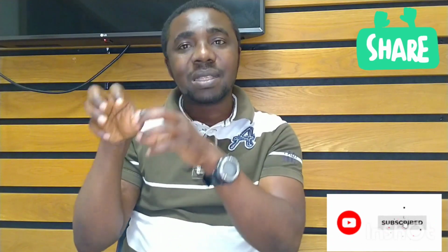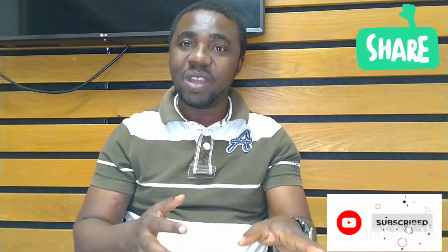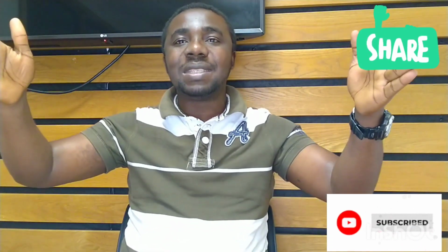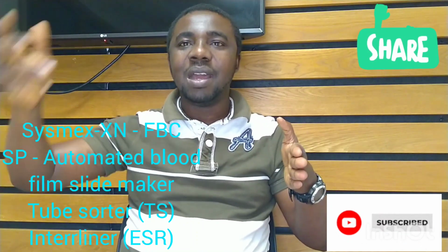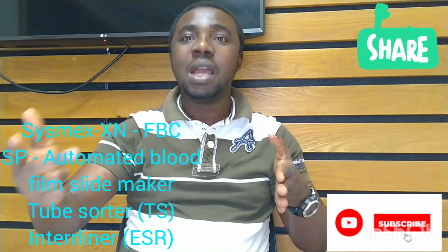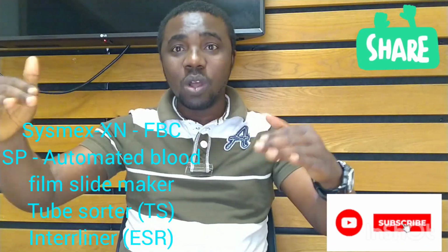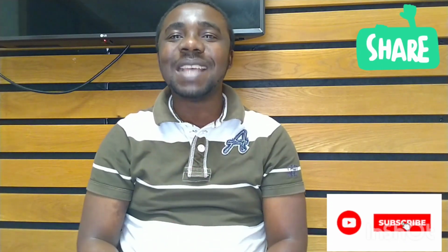Whatever you see, the sample will give you an idea of what the problem might be. Has it finished? Does it require ESR, or is there anything outstanding? The one that requires ESR will later move to the ESR analyzer. So when you talk about the Sysmex XN line, you're looking at the full blood count analyzer, the blood film making analyzer, the tube sorter, and the ESR analyzer. The whole thing is connected with a line. So that is why we call it the Sysmex XN line.